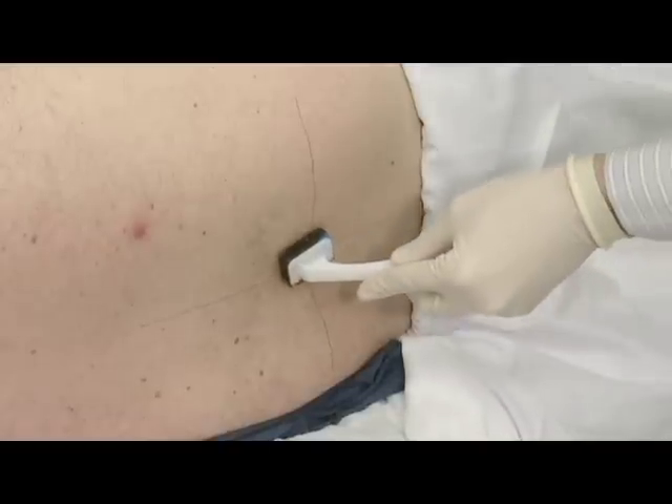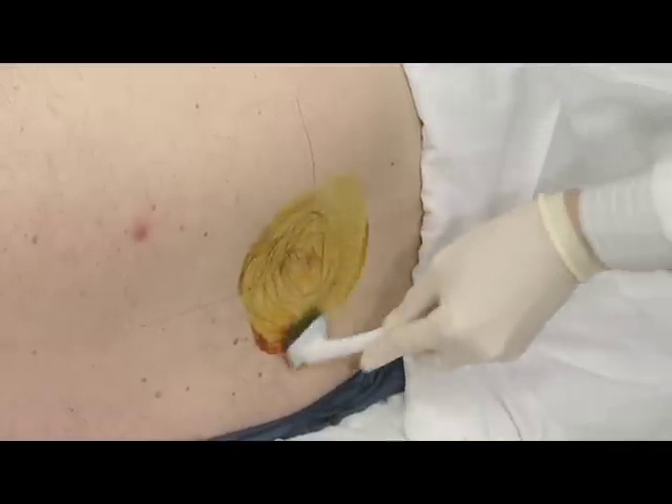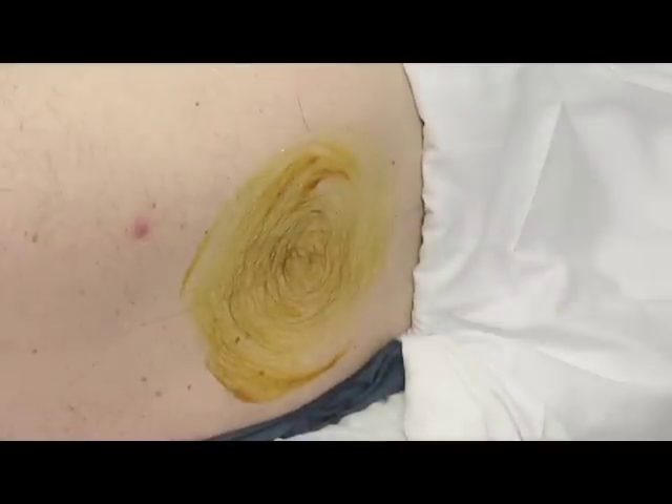To prepare the patient, clean the patient's back using antiseptic solution on the swabs, starting from the insertion site and making expanding concentric circles. This should be done three times.